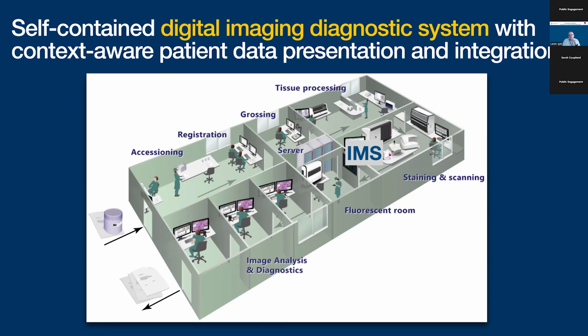And even the little things inside the system, when you look into the IMS, it is picking up all of the patient's previous attendances at the hospital, and giving you the previous histology report is a time saver. Also, because our system runs on the NHS number and is integrated with all of the surrounding hospitals, I can see their slides, and not at the moment, but shortly their data as well, which saves a significant amount of time on requesting slides.